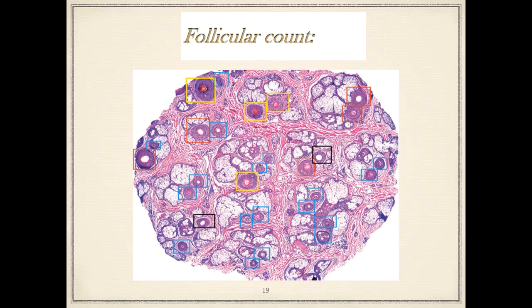This microphotograph shows follicular count in advanced androgenetic alopecia: approximately 14 follicular units, follicular density of 27, terminal anagen 5 (red boxes), terminal telogen 4 (yellow boxes), vellus anagen 16 and vellus telogen 2 (teal boxes). Intermediate follicles shown by black boxes are not included in the count. The terminal-to-vellus ratio is 9 divided by 18, giving 0.5:1, confirming advanced androgenetic alopecia.